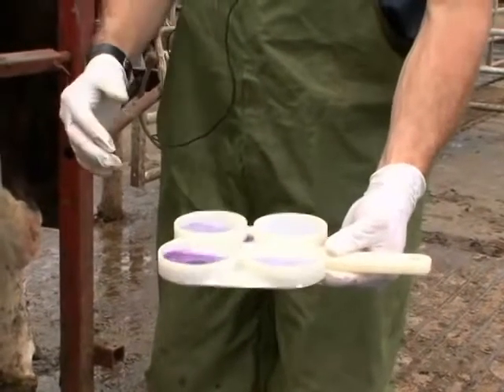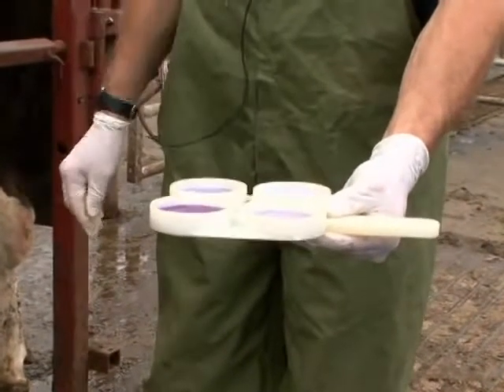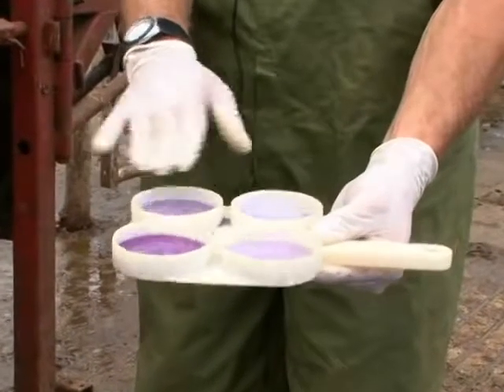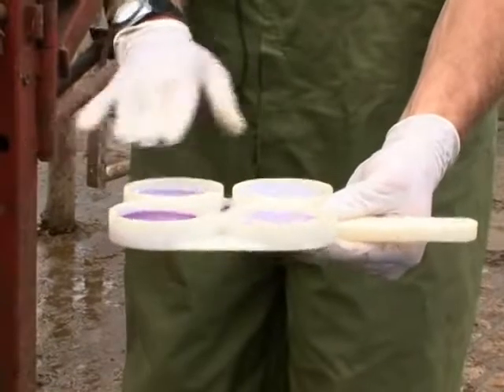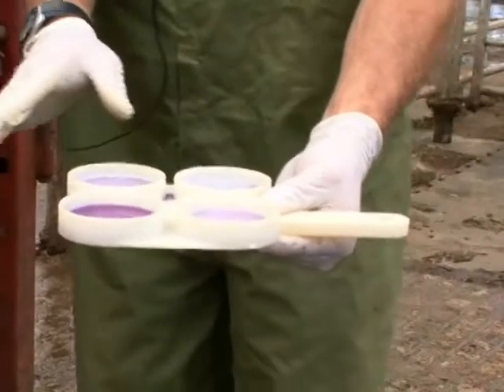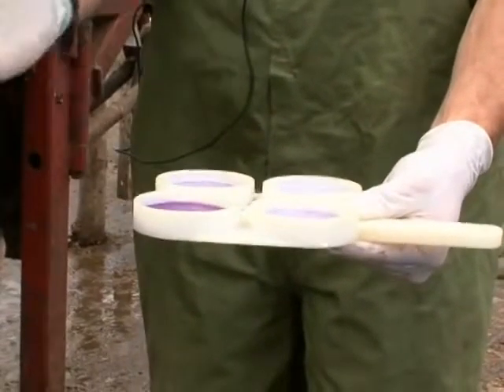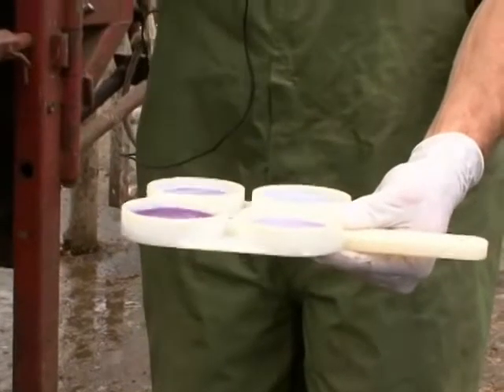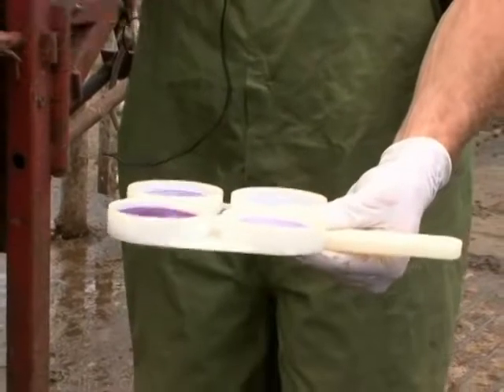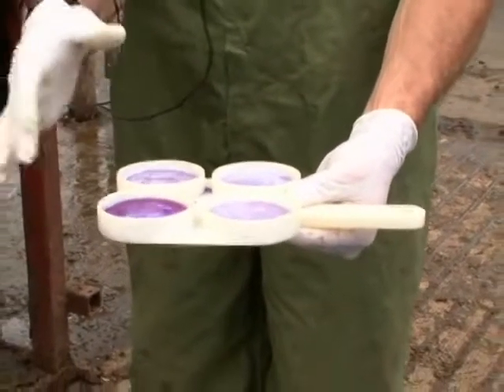Again, like I said earlier, the test is scored according to how thick the solution becomes. If we see a mixture that continues to be very watery and liquidy, that typical test would be a trace or negative. And then the scoring system goes 1, 2, and 3 beyond that. The higher you go with the number to 3, the more cells are actually in that gland, creating a thicker solution. Millions and millions of cells.